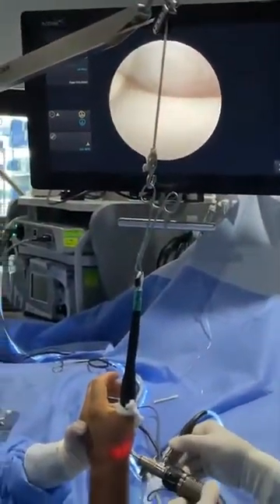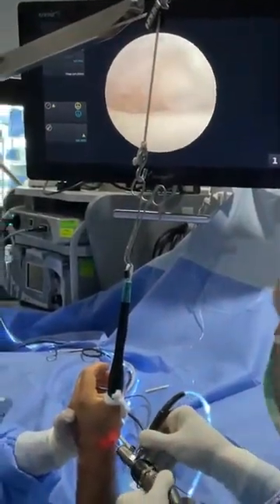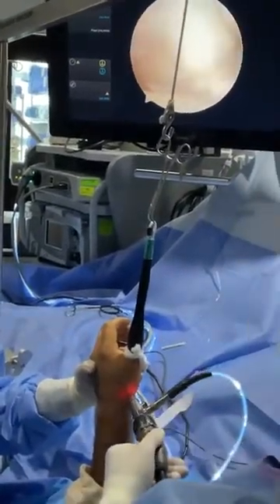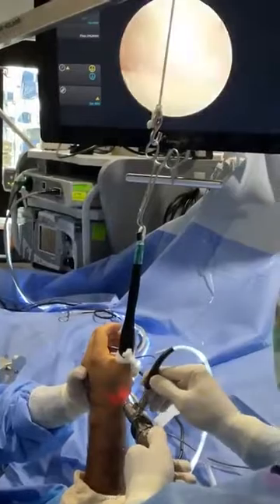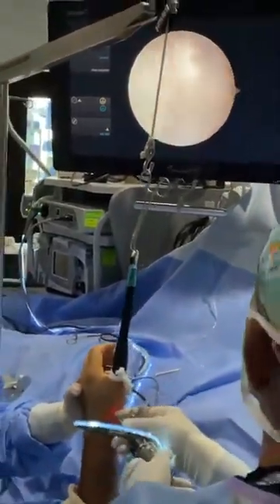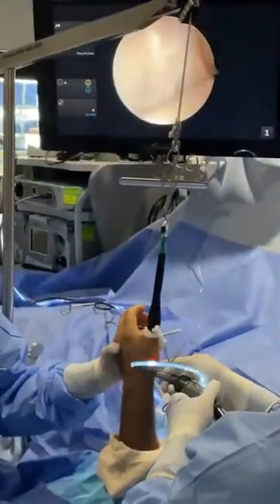I have a million patients who would love to have a joint like this. For the hand surgeons, this is the volar oblique ligament — you can see it going this way. And now we're going to look the other way and we're seeing even more synovitis and some loosening of the ligament. So what we're going to do is probably tighten that up.